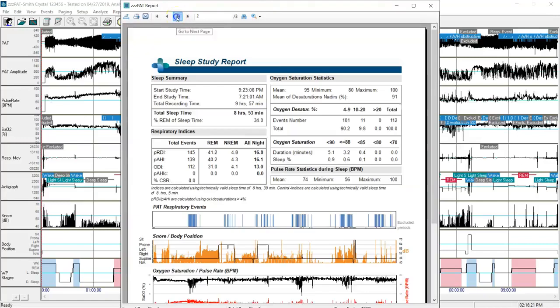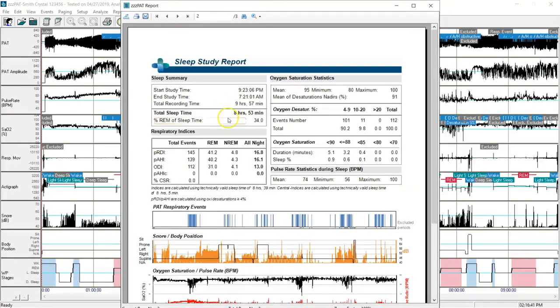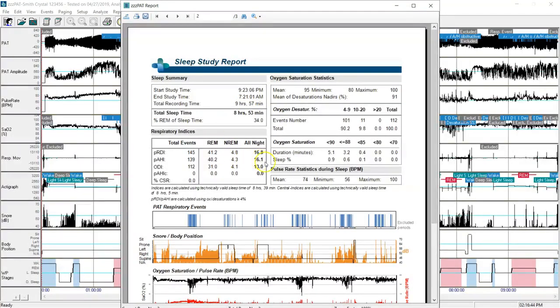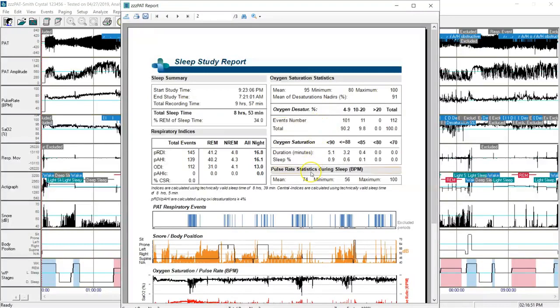I'll click on page two so I can do a review of her test study results. I see the sleep summary giving me the time values for the test. I see her AHI at 16.1. I see the oxygen statistics, desaturations, and pulse rate statistics.